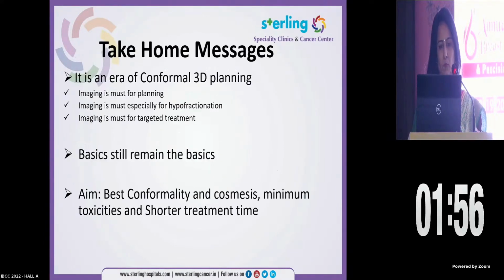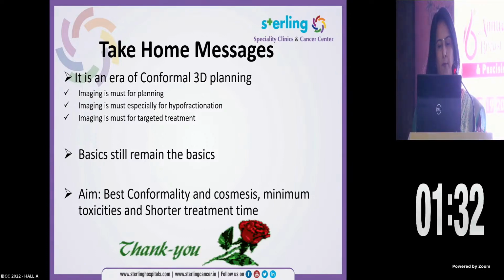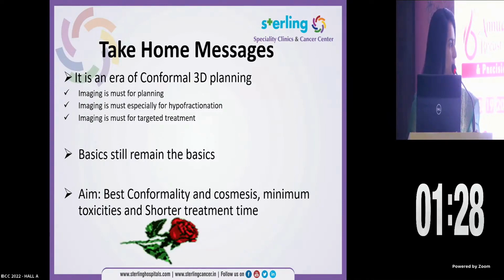So to conclude my talk, we are sitting in the era of conformal planning, where we have seen that IMRT and conformal 3D planning are really very important and have shown benefits, but imaging is always the backbone. Also, the backbone is the basics, which we should not forget. And ultimately, our aim is to have the best conformality, best coverage with minimum toxicities and in a shorter period of time. I thank you for your patient hearing and would be happy to take any questions.